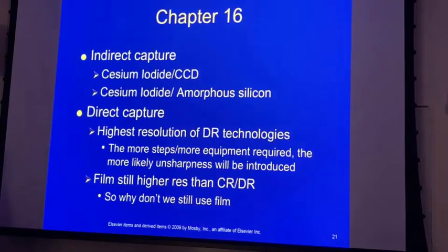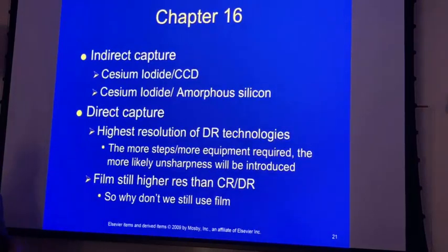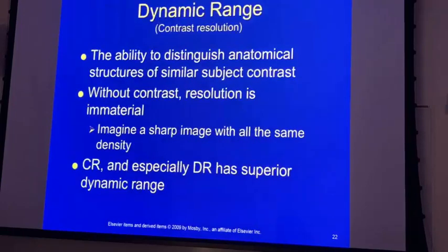If it was in the arch of the foot, totally different technique. If it was in the heel, still a different technique. With CR and really with DR, one technique gets it all. So contrast resolution and the ability to make a diagnosis based on that contrast resolution is so much better with DR.